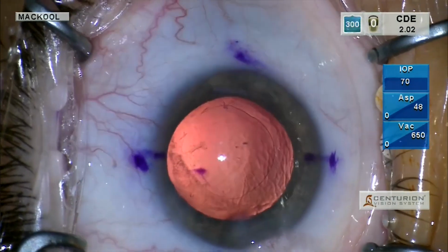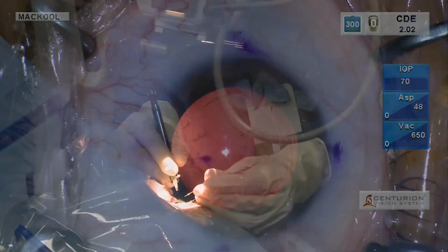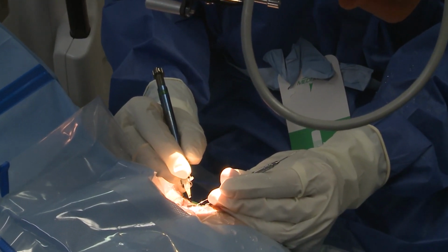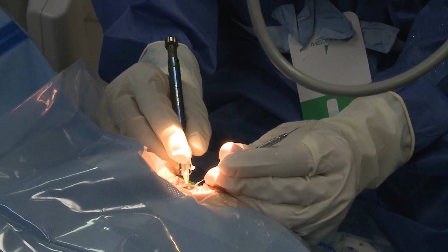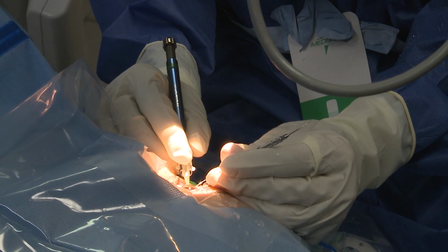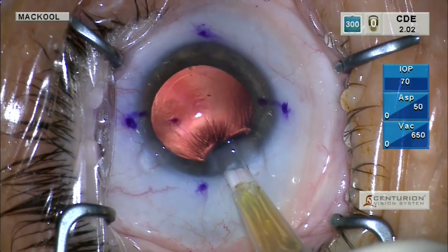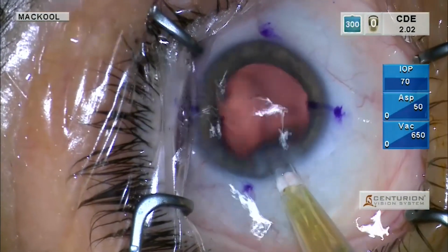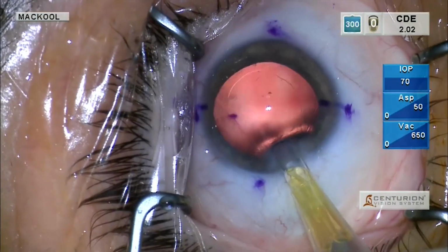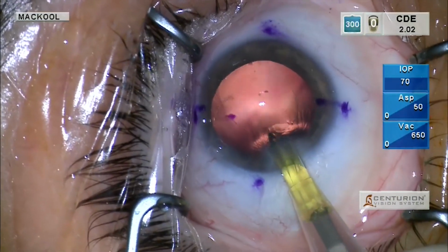We're now ready for intraocular lens insertion. Stabilization of the globe with the left hand. Partial insertion into the tunnel. And this is a Monarch D as in David cartridge. Wet the cornea, please. Watch how those stria become less obvious when the cornea is wet. Good. Improving visualization.